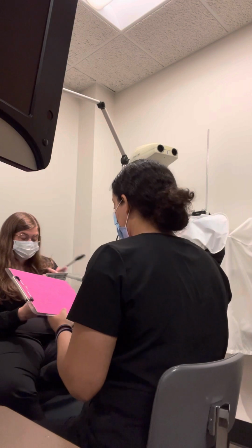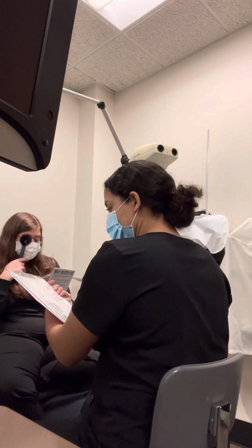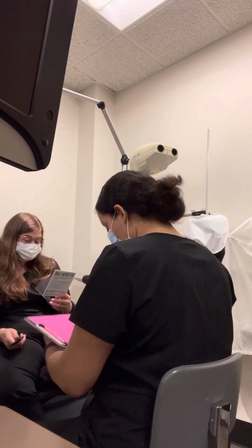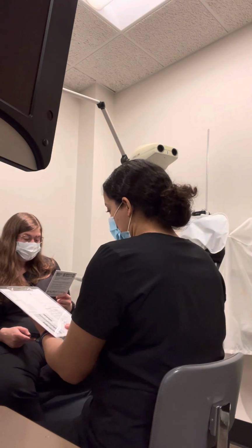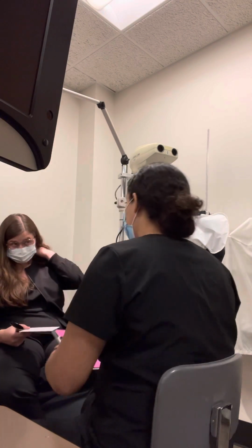Okay, go ahead and cover up your right eye for me. What's the lowest line you can read without squinting? DLNGYS. Awesome, thank you. Okay, and with both your eyes and without squinting, what is the lowest line you can read for me? DLNGYS. Okay, I'm gonna go ahead and take your glasses from you.